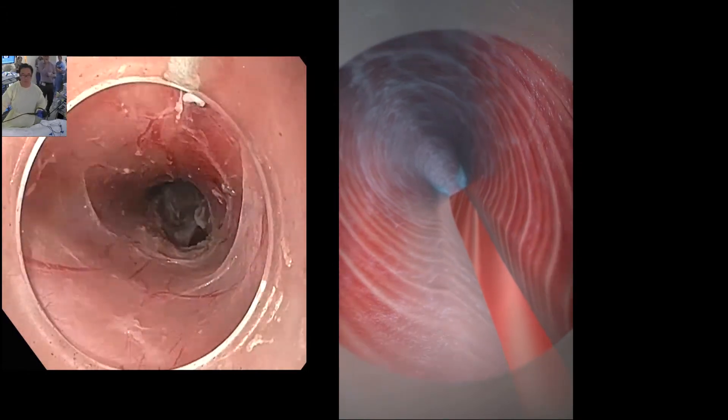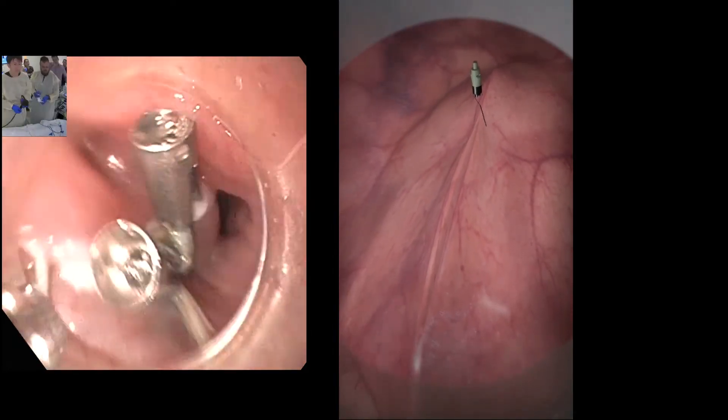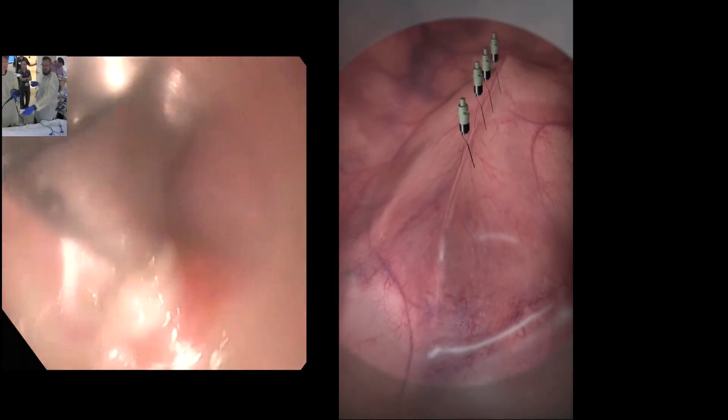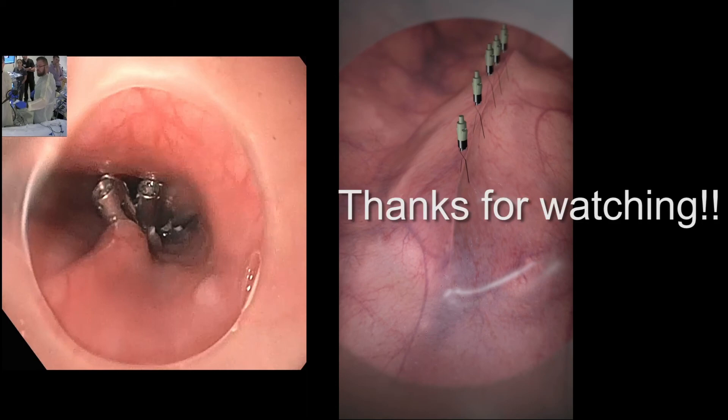Once the scope is out of the tunnel, then it's time to close that mucosa with typically five of these very short little metal clips. These clips, once the wound has healed, will fall out into the stomach and go out the other end without patients noticing. So this is the entire POEM procedure summarized in this animation.